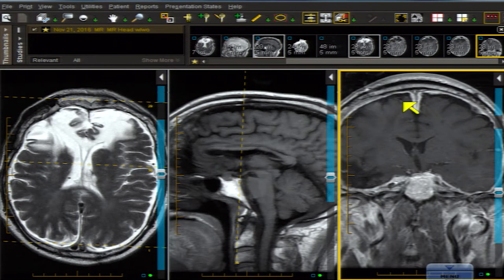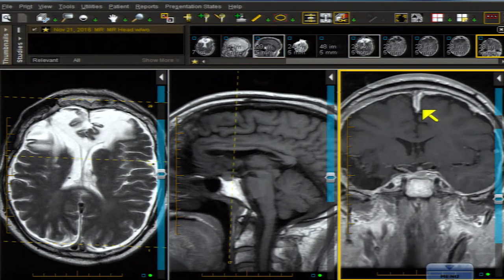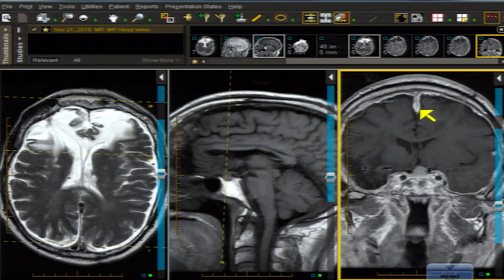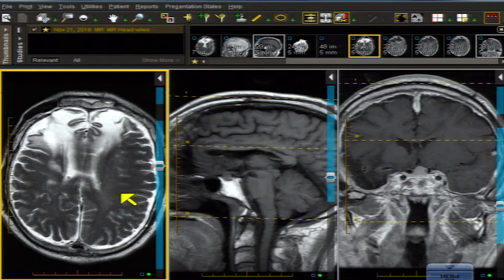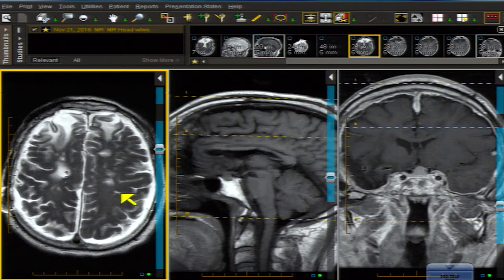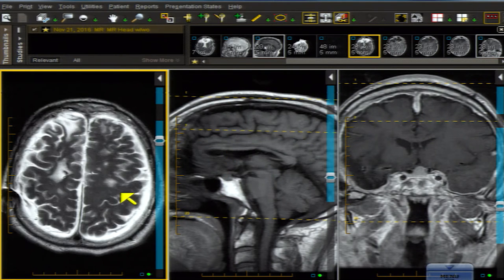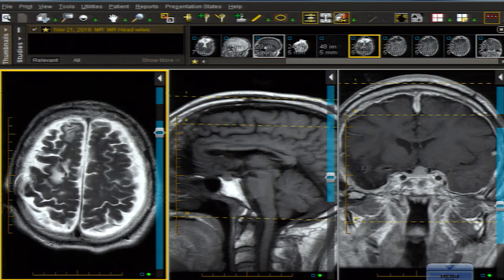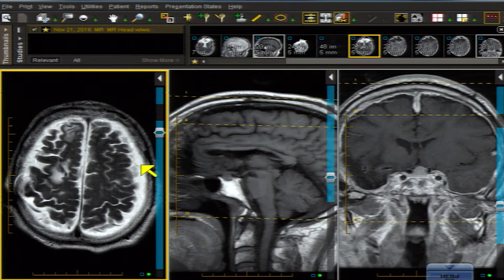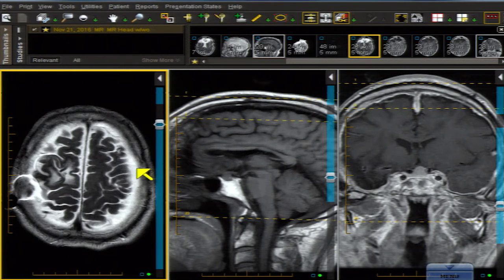My idea of something being rotten in the state of pia and arachnoid is wrong — it's actually the dura mater, the pachymeningeal. That's correct. And also, if you look here on the T2, there's a thin extra-axial collection.